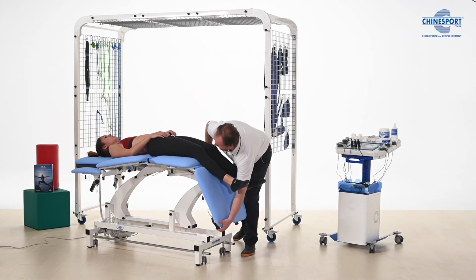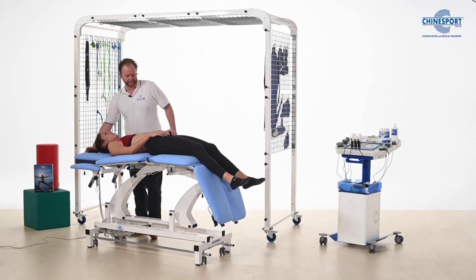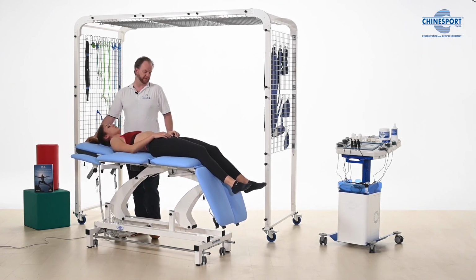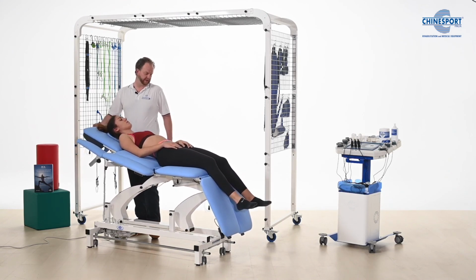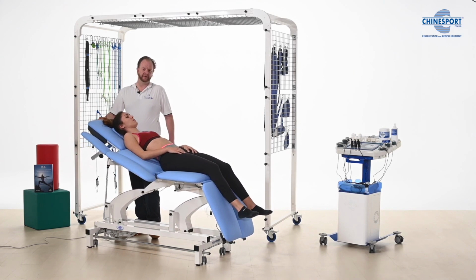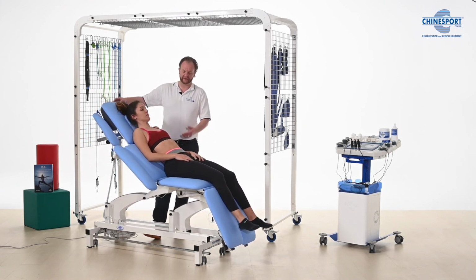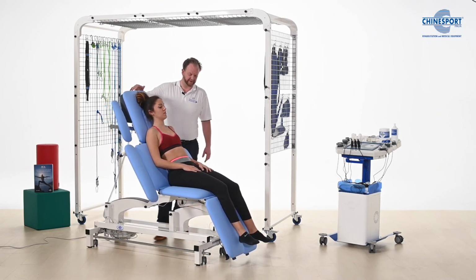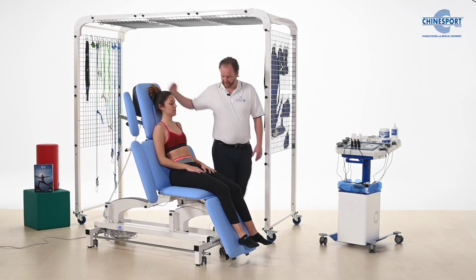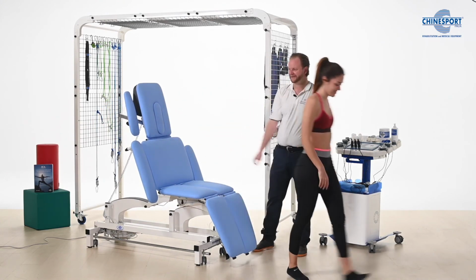We're just going to put her up. And here, we're going to bring her up. And of course, if you have patients that you want to treat in a sitting position, then in your physiotherapy practice, your rehab practice, you now have a table that you can shape into a couch very easily. There we go. You can give me a hand, and I can take you away.